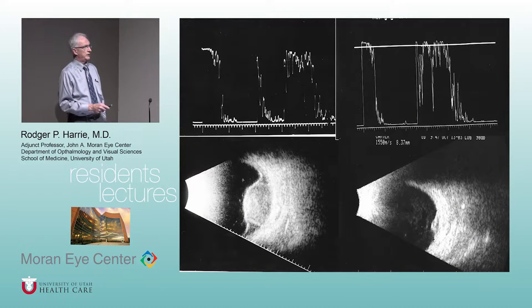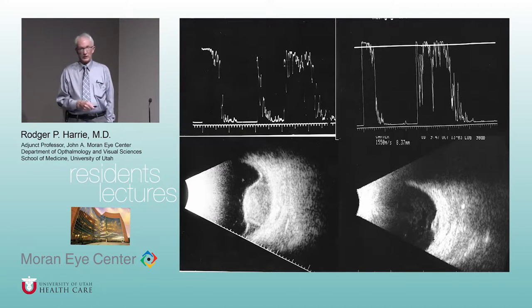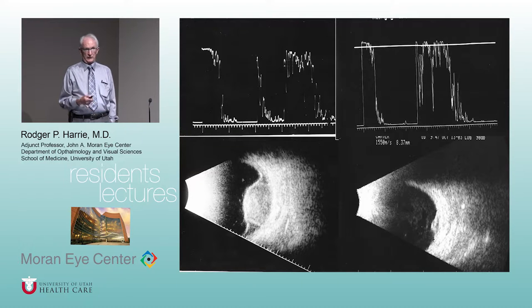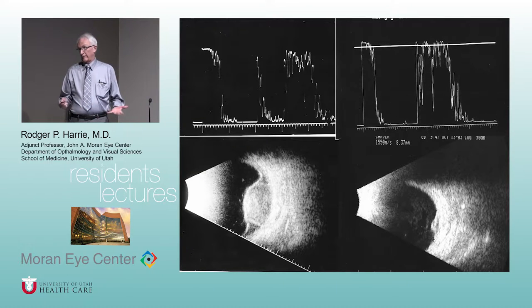Post-radiation therapy. Here again is a melanoma - the B-scan shows the lesion and the A-scan shows inside it: low-reflective and regular. Those are the diagnostic criteria. After radiation, they get smaller - that's the hope. But also reflectivity changes internally. As they necrose, as blood vessels atrophy, instead of being low-reflective and regular, they become irregular and high-reflective due to interface changes. Melanomas are very homogeneous and dense - that gives the low appearance. As they become more necrotic, more interfaces are created and you get more reflectivity. So you watch both size reduction and internal reflectivity change, plus vascularity - they become avascular as they die.